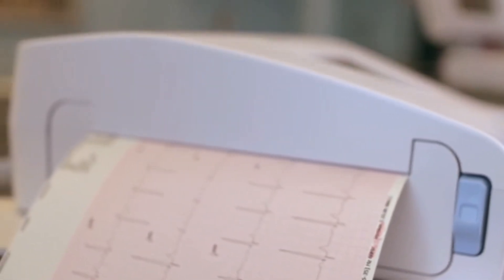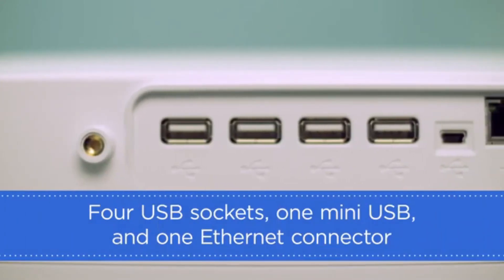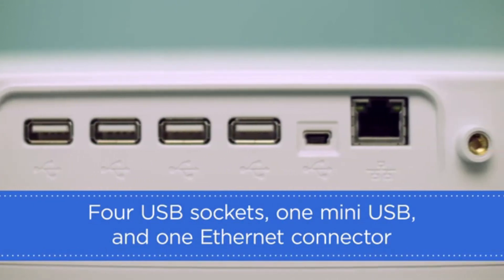It has a built-in printer which prints out the results on A4 sized paper. The device contains four USB sockets, one mini USB, and one Ethernet connector for wired connectivity.